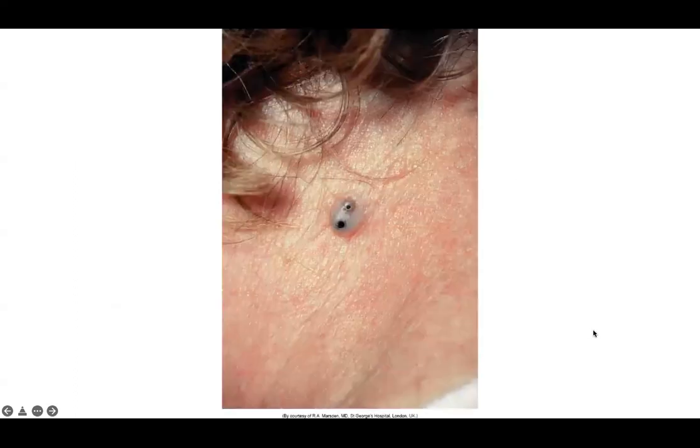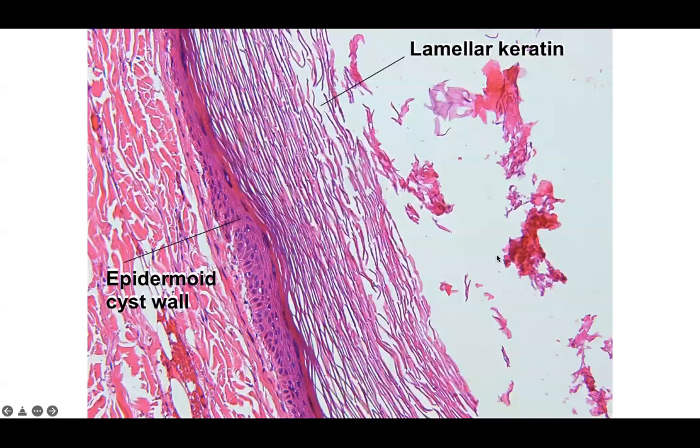Here is just an epidermal inclusion cyst. You can see some punctum on top, some oxidized keratin at the base of that punctum. The epidermal inclusion cysts have that shredded wheat or onion skin lamellar keratin, the retention of the granular layer, and stratified squamous epidermis along the outer edge, and you do not see direct connection of adnexal structures to the lining.